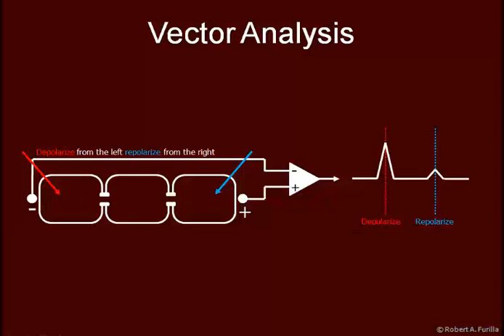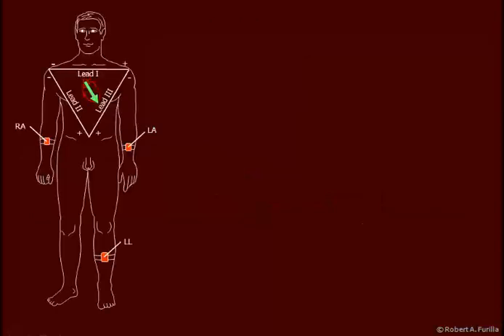The T wave may be inverted following a myocardial infarction. It may also be inverted with potassium imbalances, or the limb lead, for example, AVR, normally shows an inverted T wave simply because of the direction of the placement of the electrodes. In this figure here, I'm showing the Einthoven triangle, which is made up from 3 limb leads.